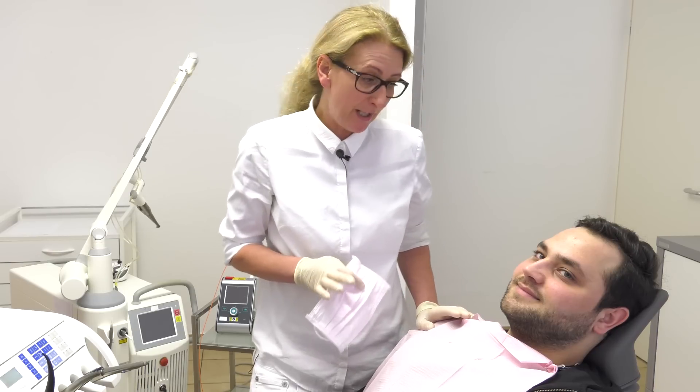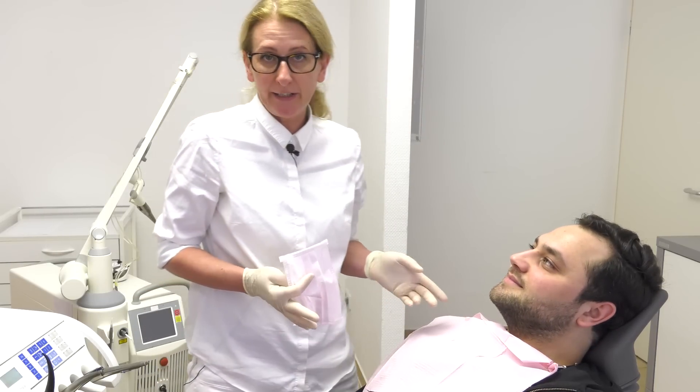We will combine the Erbium YAG laser and the diode laser. Cleaning of teeth by using a laser - let us call this kind of treatment the cleaning and care package - is a combination of conventional and modern treatment in dentistry. It means that we take the advantages out of both medical equipments. Our treatment procedure is divided into three steps. Step number one is taking off the tartar.